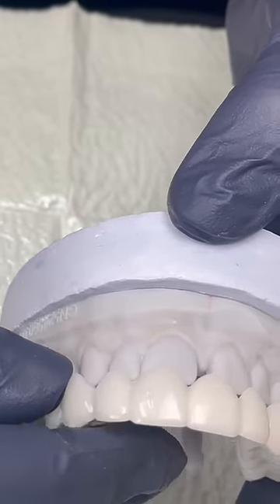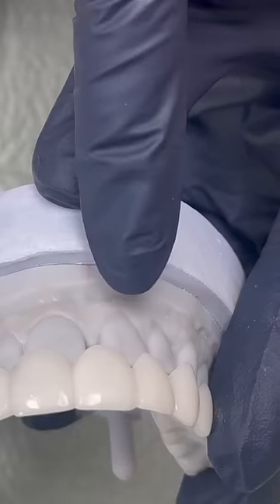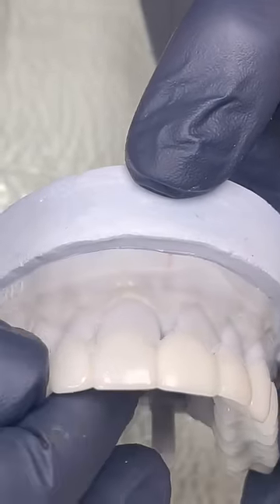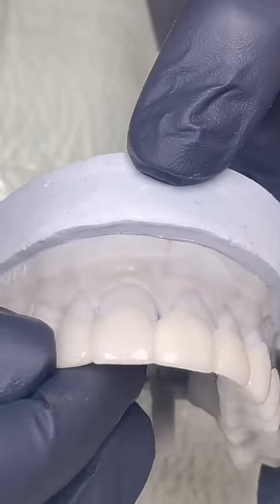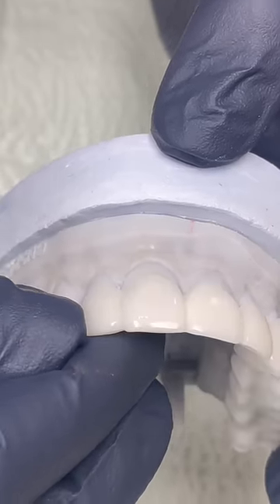But if you look close, you can see that this tooth ends further to the midline than her natural tooth. So we made four teeth smaller than her actual four teeth. It's called superimposing. And I'll show you what it looks like in the mouth.